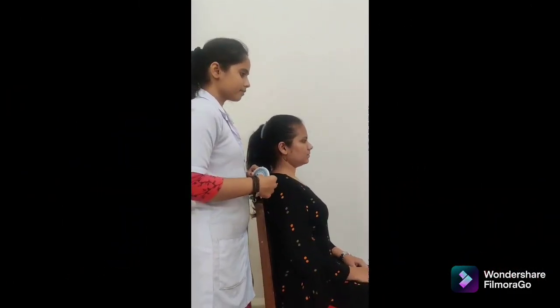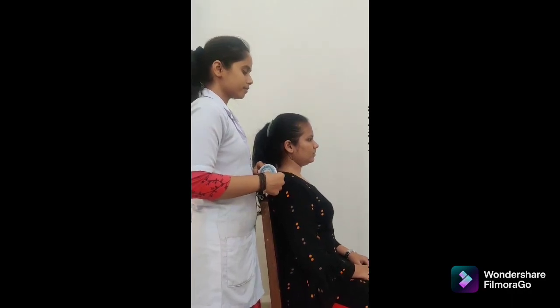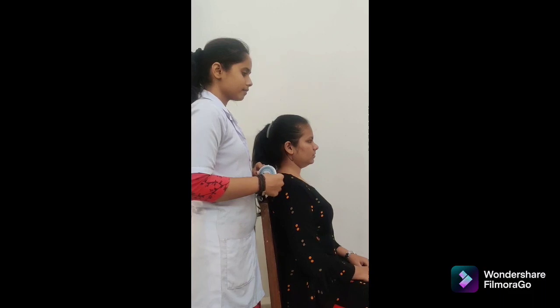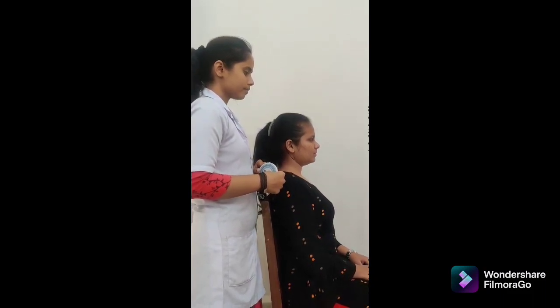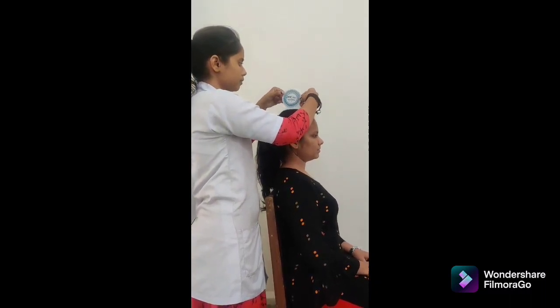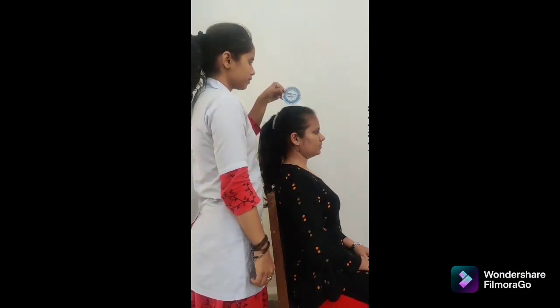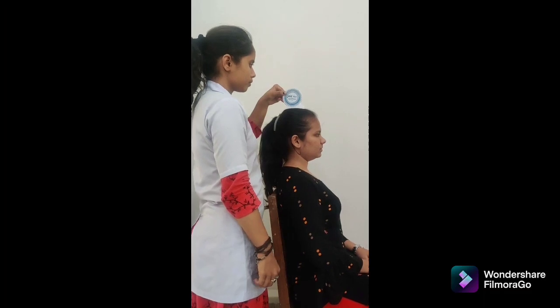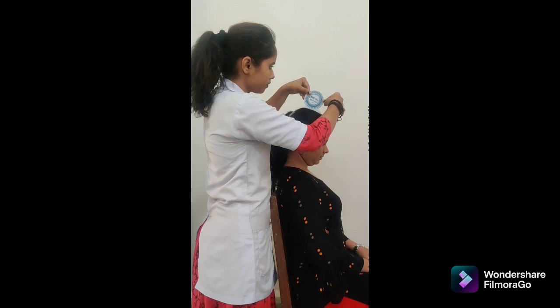We are going to perform cervical flexion with inclinometer. Patient position: high seating with thoracic and lumbar spine supported by back of chair. Inclinometer alignment: place inclinometer firmly on the top of the head, adjusted to 0 degrees. Instruction to the patient: bend the head forward and downwards while keeping the trunk straight. At the end of range of motion, read and record the degrees on the dials of the inclinometer.